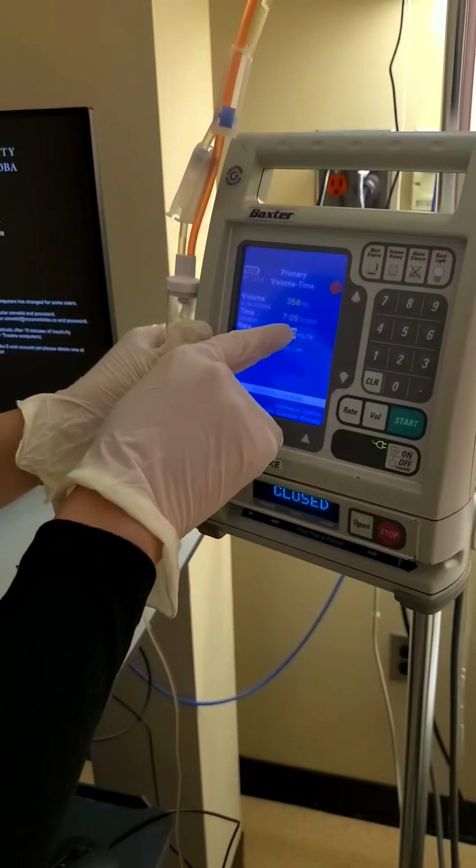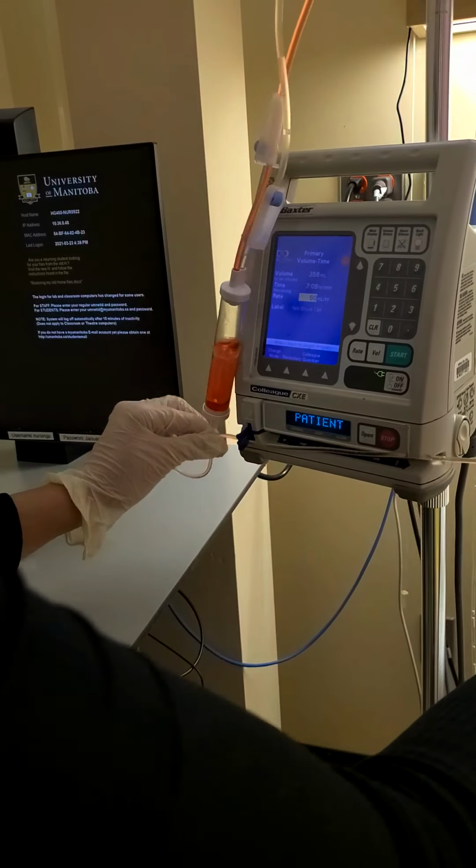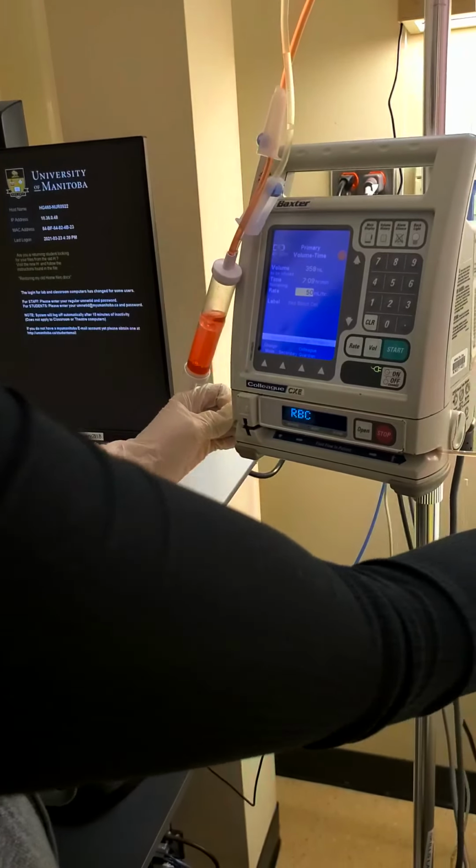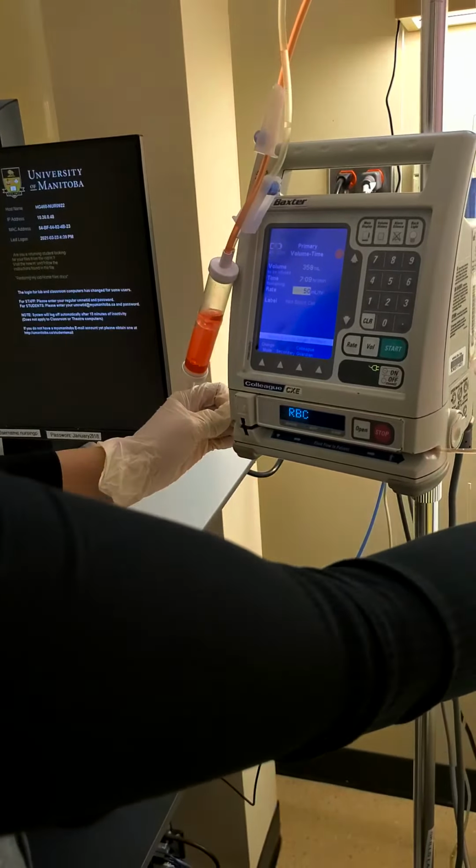Move this down here. Okay, now that it's in, we can now connect it to the patient. We're gonna check for the patency.